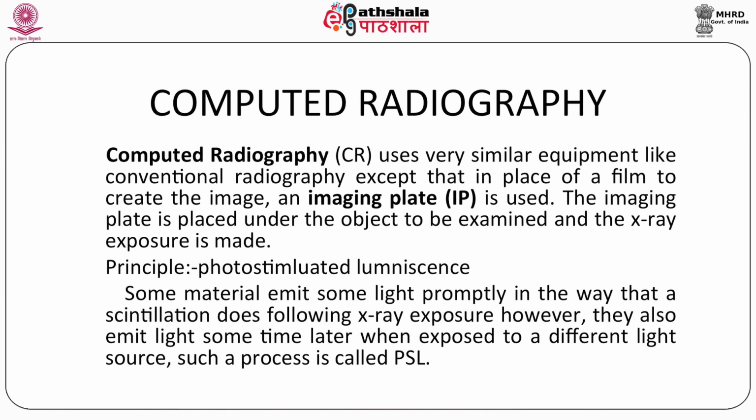Now coming to computed radiography, it is a computer based radiography, a digital way of doing general radiography with a conventional X-ray machine. It refers to the projection of an X-ray image using a photostimulable phosphor plate, the PSP plate.